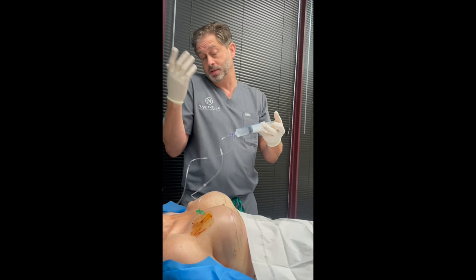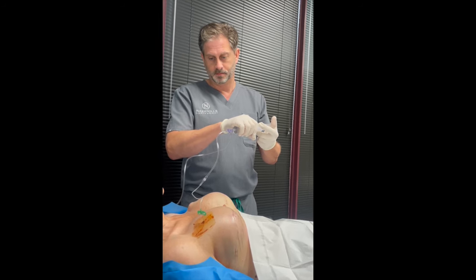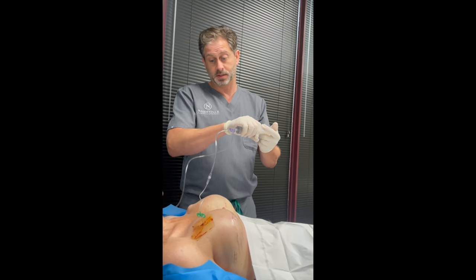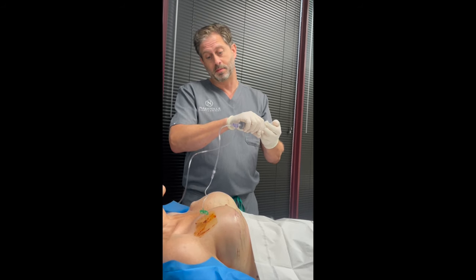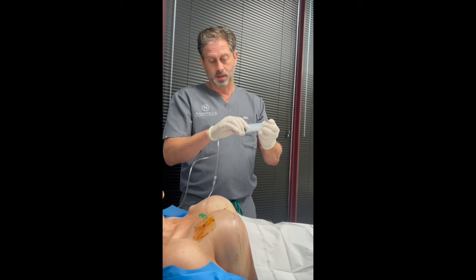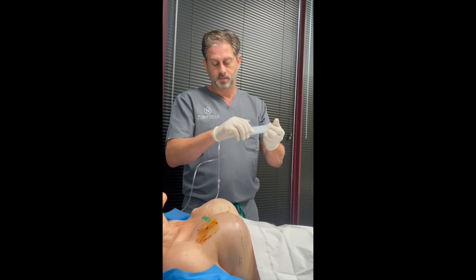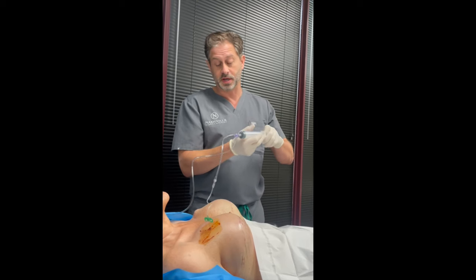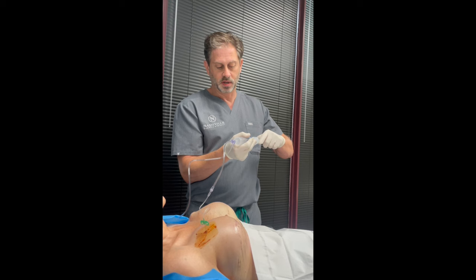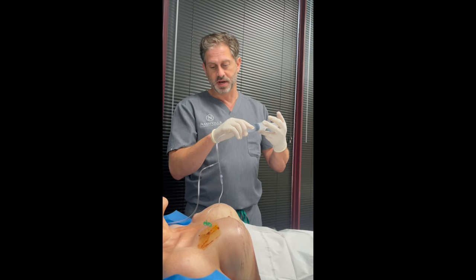Typically this process is about four to six months from the first operation to exchange for the permanent implants. Radiation can change that story a little bit, but we do the expansions every week at about a hundred cc's a week depending on how well the patient tolerates it.